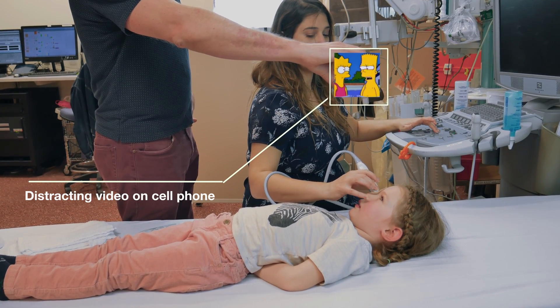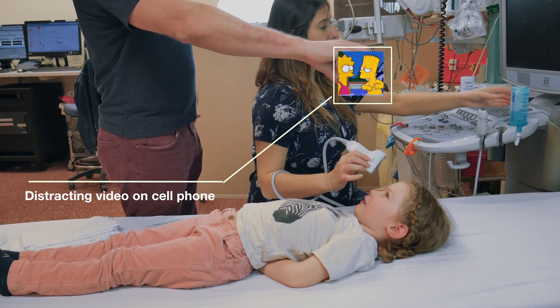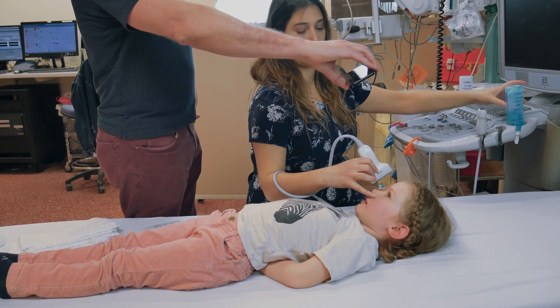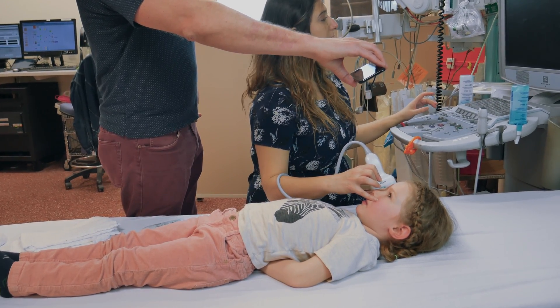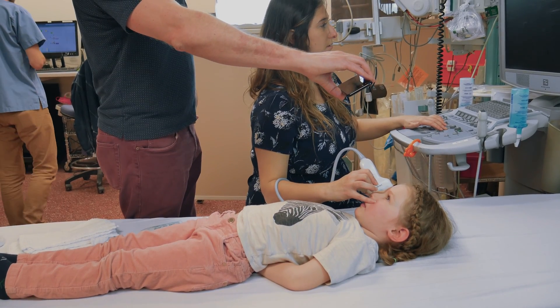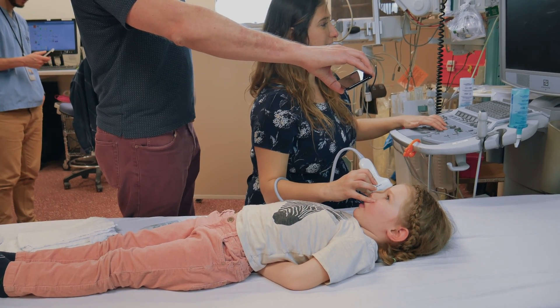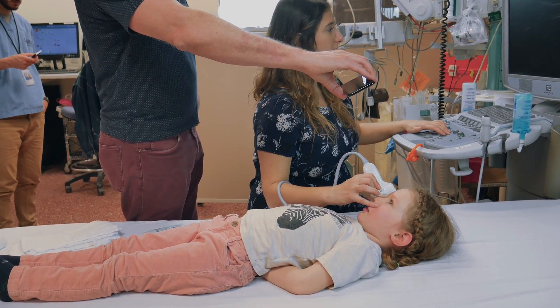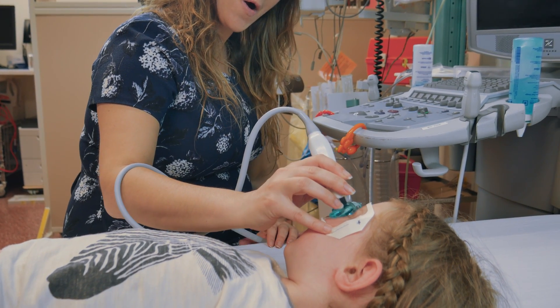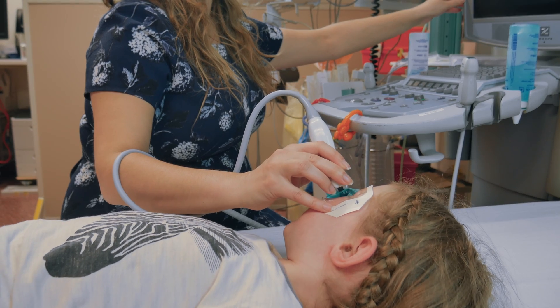Having an object that the child enjoys watching or the TV on may alleviate some of their anxiety. At times, none of these methods will work, and the parent may need to hold the child's arms and head in a similar manner to facilitating a throat or ear exam. The optimal position is to have the child recline to 45 degrees, but if the child will not cooperate, you may have to scan with the child sitting at 90 degrees, lying down at 180 degrees, or somewhere in the middle.